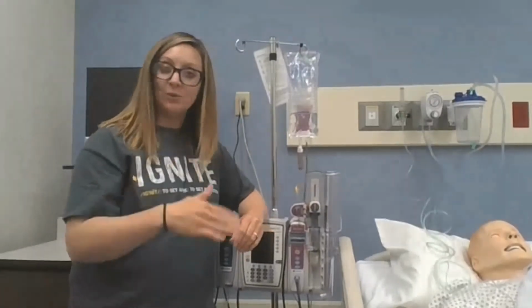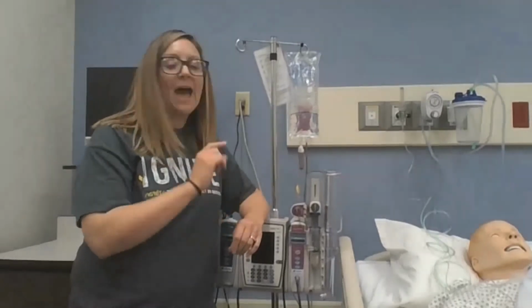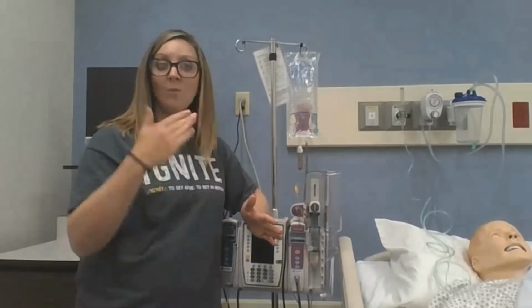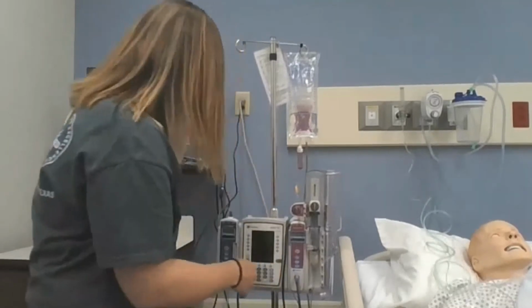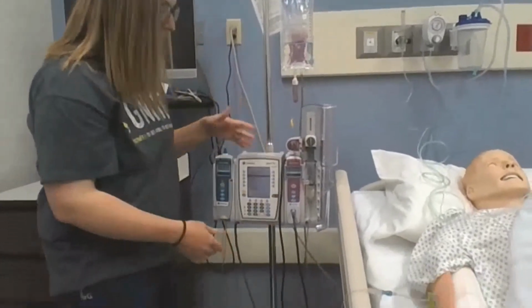And if you don't have fluid infusing, they are not going to have the medication enter that vasculature. It's not going to enter the circulatory system. And so essentially your patient won't be getting any pain medicine. So you need to make sure that you have fluids, even just infusing at 20 cc's an hour to help keep it flushed and continuous. So when they hit the button, it helps push that medication. So we are going to program our pump.